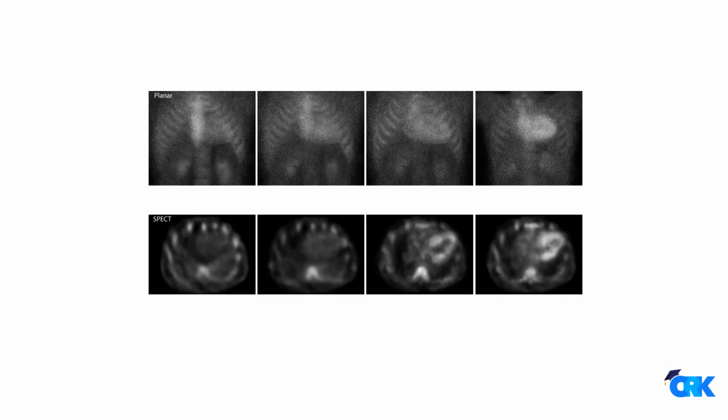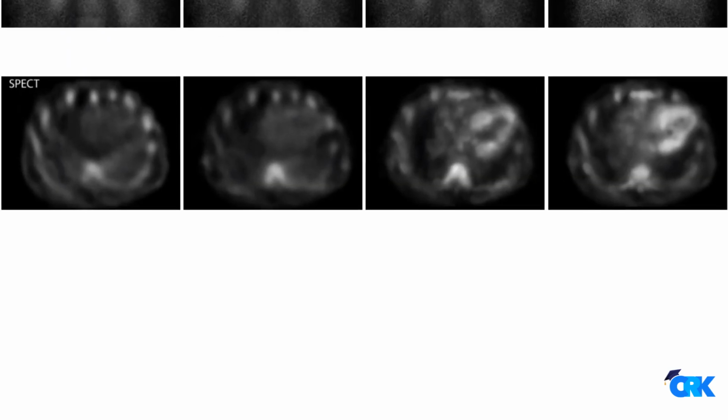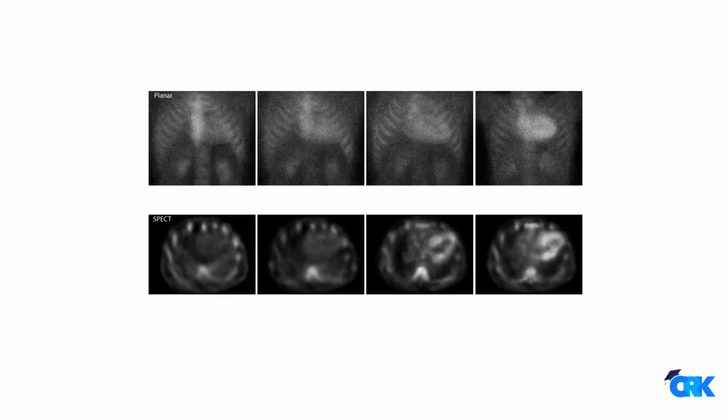One key consideration is timing. If the initial 1-hour scan shows ambiguous uptake that could be due to circulating tracer in the cardiac chambers, a delayed acquisition at 3 hours is recommended to improve specificity and clarity. The lower panel visually demonstrates this principle. Here, SPECT imaging is shown to refine the diagnostic picture by clearly differentiating myocardial uptake from surrounding structures. This refinement is crucial, especially when the planar scan presents borderline or indeterminate findings.